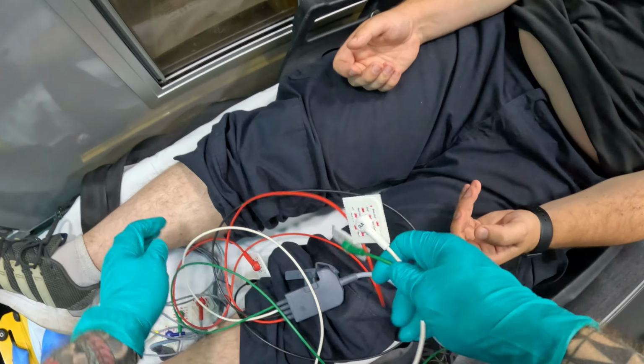So if I'm looking at the patient, I'm going to go clockwise, right? Clockwise, salt is white color, right? Salt is going to go right arm, but you don't have to remember right arm, right? You just remember salt. Salt is white right here, right? You see what I'm doing? Salt, right? Next thing we're going to do is pepper. Pepper is black in this case, right? Salt, pepper. And then we're going to do ketchup. Ketchup is red in this case.